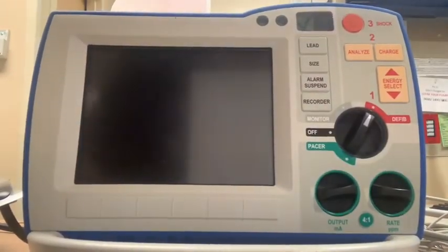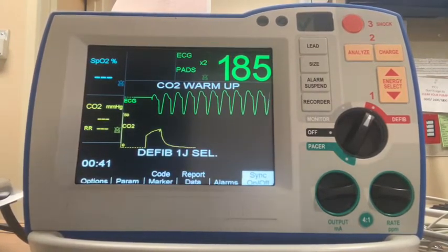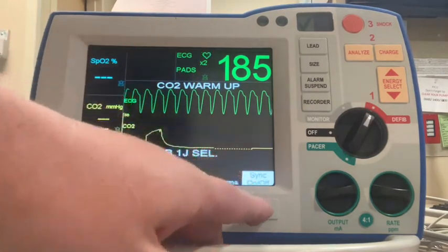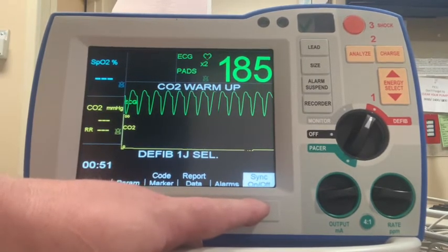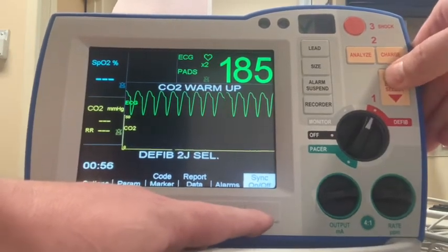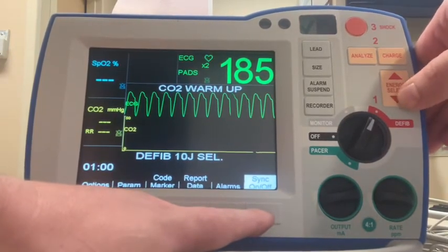Now let's say I connect it. I've got my VTach, and there is a pulse. The doctor says let's cardiovert, or per PALS, we would cardiovert. So based off of our PALS protocol and what's written on our sheets, we select the joules. Let's say it's 10 joules for whatever weight the patient was.